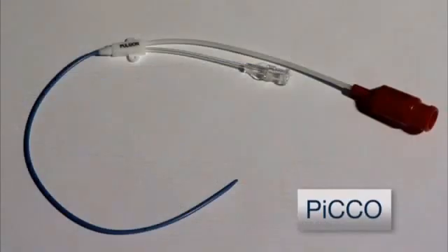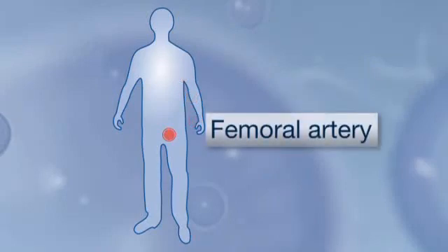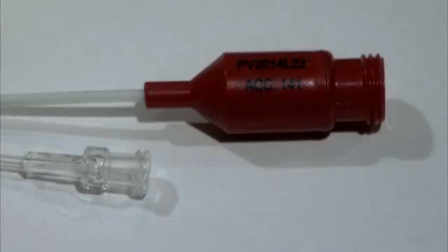The choice of appropriate PiCCO catheter is guided by the patient and the site of insertion. The catheter is usually introduced to the femoral artery. The 20 centimeter catheter is most commonly used. The 22 centimeter or even the 16 centimeter in small patients can be used.